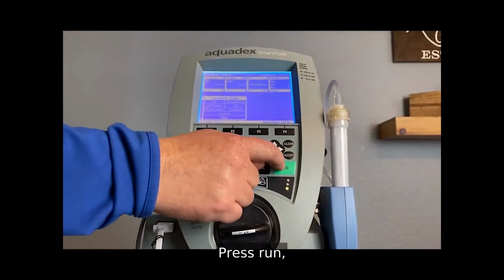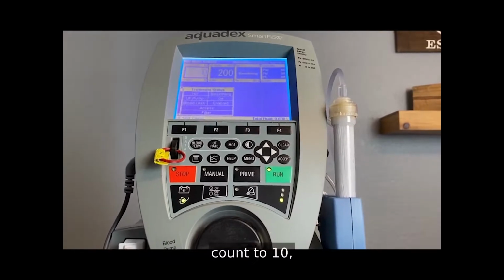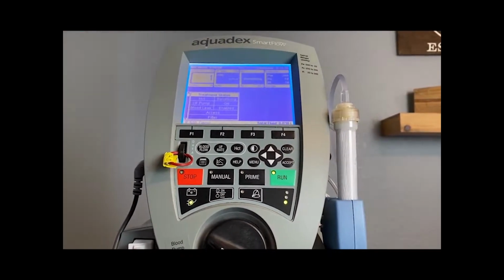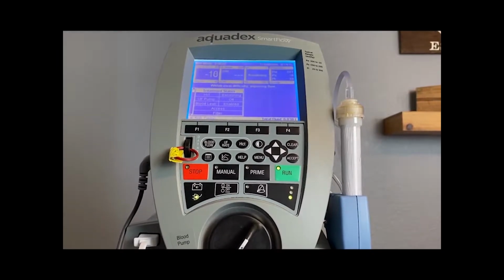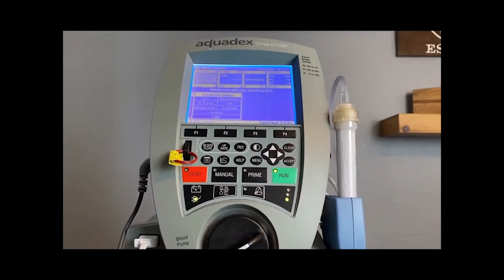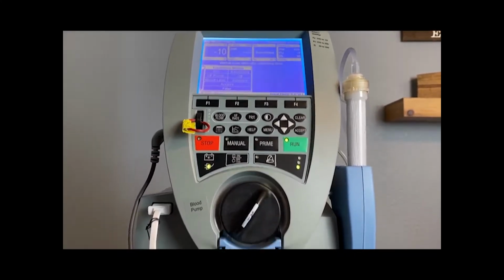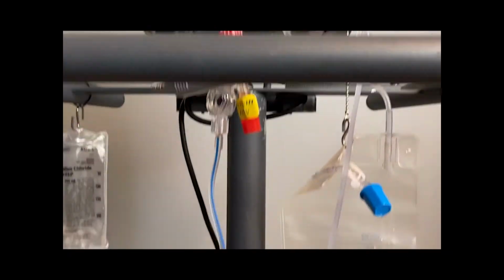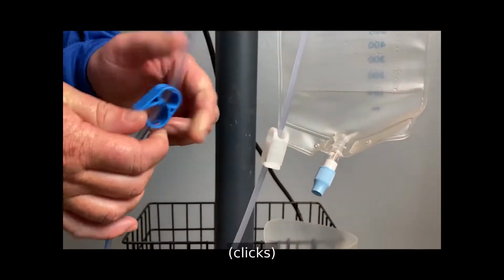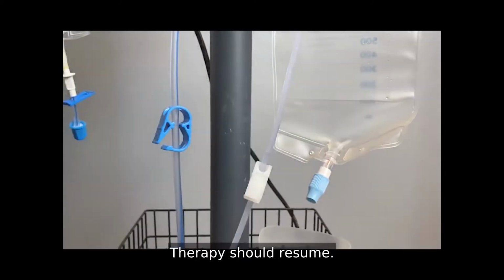Press run. Count to 10. Open circuit clamps together. Therapy should resume.